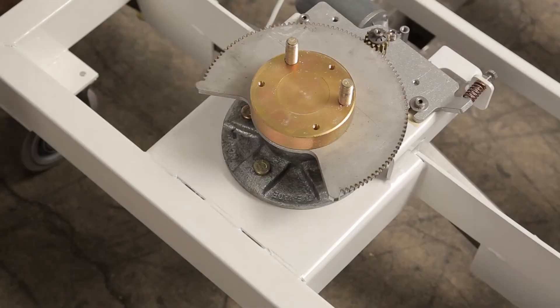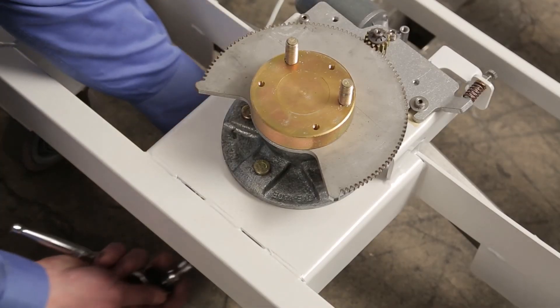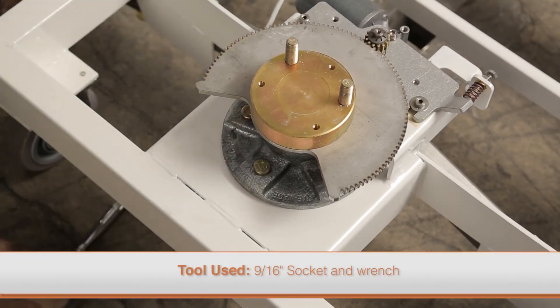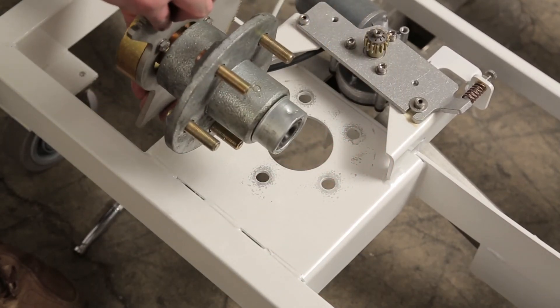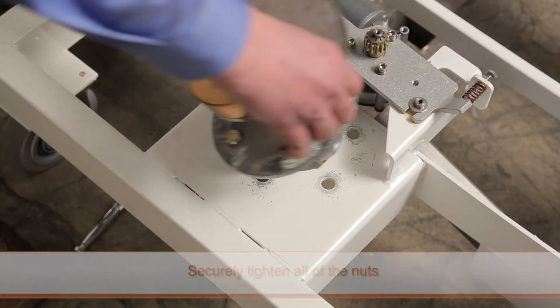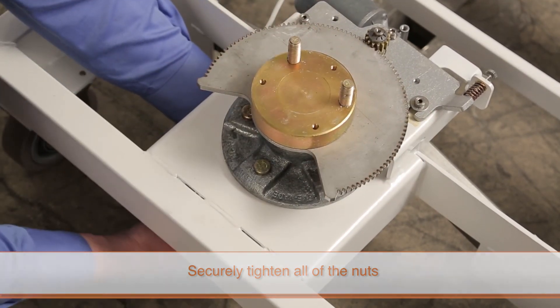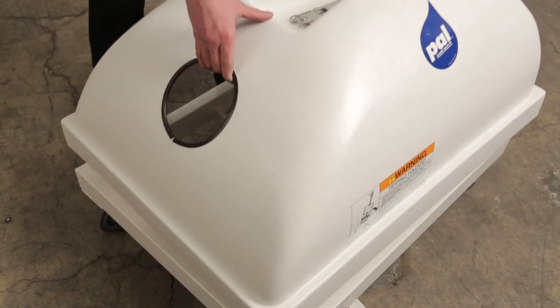If the large gear is damaged, the hub assembly needs to be replaced. For the PAL and PAL 2, the nuts that secure the hub assembly to the frame must be accessed from underneath the frame using a deep well socket. Loosen the nuts and remove the hub assembly. To replace it, align the studs with the holes in the frame, insert the hub assembly, and install and securely tighten all of the nuts.